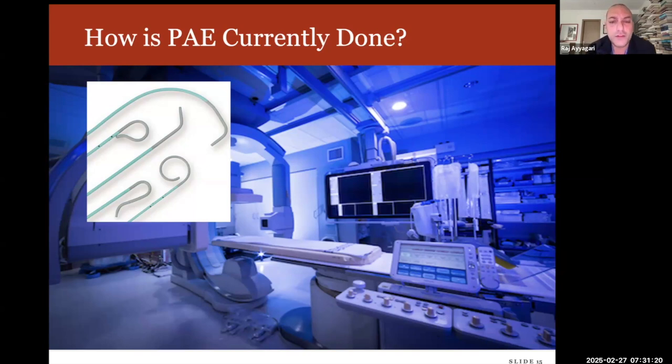So femoral or radial access. What do you guys do there mostly? Do you do radial access at all? Mostly femoral. Okay. Yeah, me too. I like femoral a lot better than radial, but radial is always an option, or typically an option. We'll just put a small sheath in, and then a 5 French catheter. I don't know if you guys are familiar with the names that we use, but something called an SOS catheter. It's this one here with this hook on it in the picture.